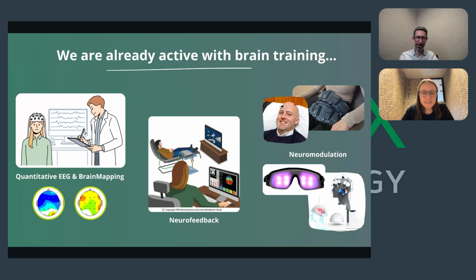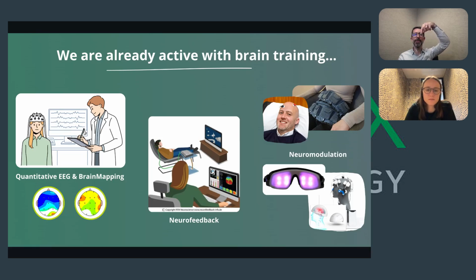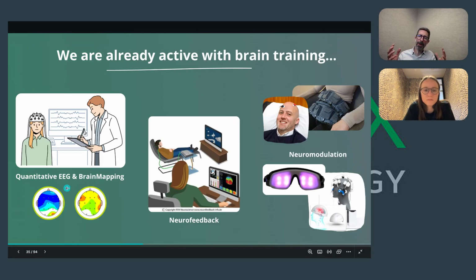Mélanie, while we're on this slide, and for those that aren't so familiar with the things we see here on the screen, can you point out what they are? On the left, we have those two graphs in color. Basically, this is a view from the top of the head, where the nose is the little pointer that we see on the north side of this round thing, and the ears are on the side. Exactly. And the different colors basically represent if something is overactive or not active enough, this kind of thing. Yeah, exactly.